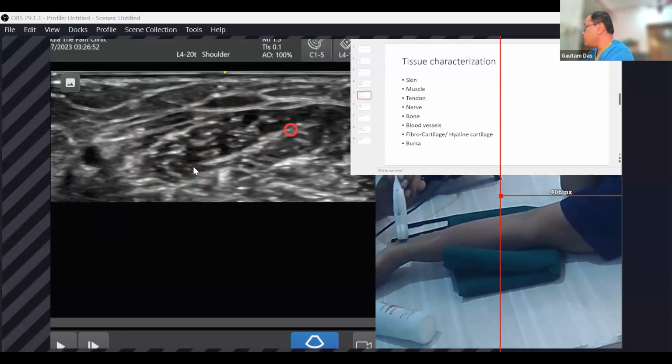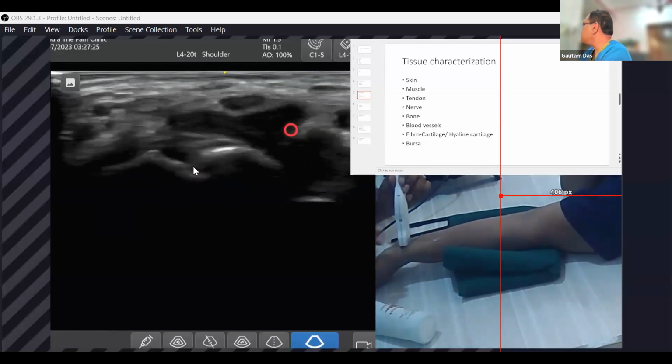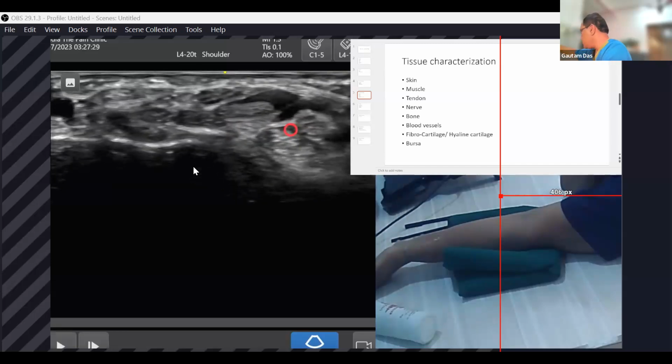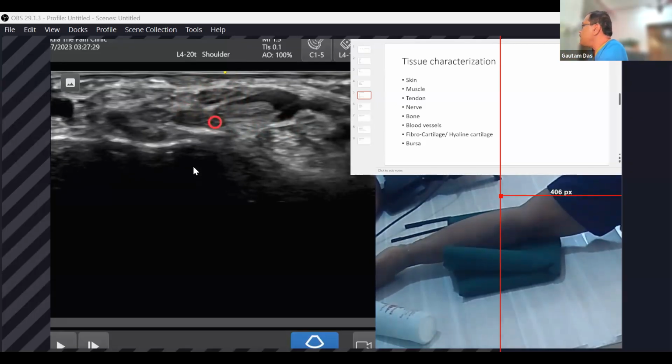When you see the nerve also, here it was the median nerve again. So here the above cover is your epineurium, and the white structures you can see are your perineurium, and the endoneurium is very thin, we cannot see the endoneurium. So a few bundles together are covered by the perineurium. So this white structure is your perineurium, and the overall covering is your epineurium.